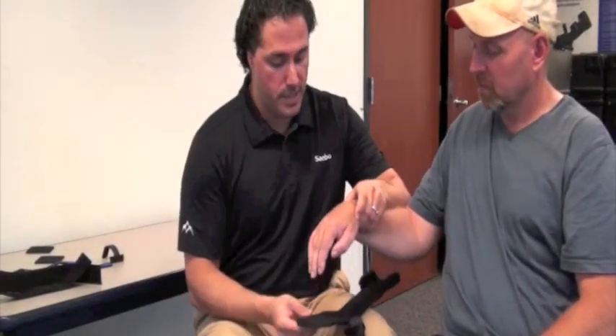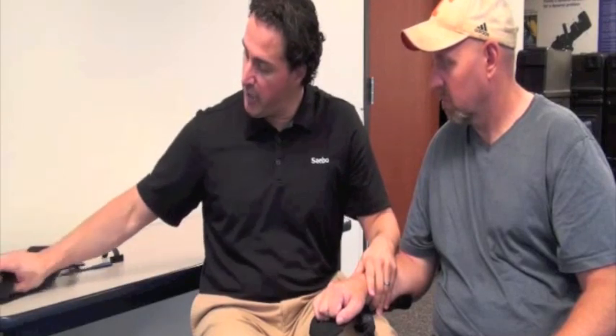To put the device on Tony, I like to have his fingers straightened and try to get him all the way to the edge of the splint handpiece. That tells me that the forearm is positioned correctly. If Tony can't stay in this position because of the tone, it's okay if the fingers curl in while we apply the forearm straps.